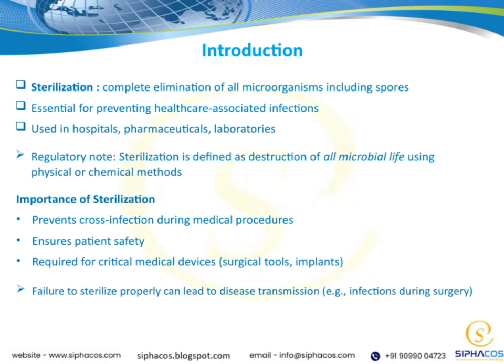Sterilization is especially critical for certain medical devices like surgical tools and implants, which come into direct contact with sterile tissues or the bloodstream. Failing to sterilize properly can have serious consequences, including the transmission of diseases or infections during surgery. Now, to clarify, sterilization means the complete elimination of all microorganisms, including spores, which are particularly resilient.